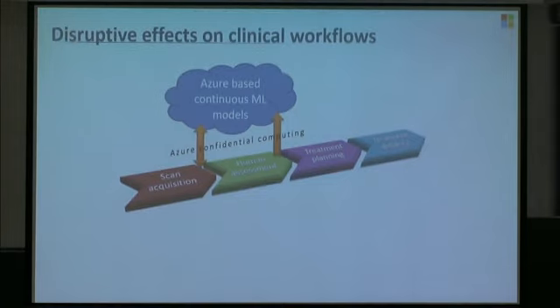What we've got now, and we've just got permission from Information Governance to do this, is the radiomics tool we're using now in Addenbrooke's. We have a device in our radiotherapy network that takes the pixels from the images that we scan and feeds them up to ML models that are actually based in the Azure cloud. One thing that made that happen, released just earlier this year, is Azure Confidential Computing. This is end-to-end encryption of data that goes into the cloud for analysis. The transmission, even at the actual computation stage, be it on a GPU or CPU cluster, and it coming back, is all encrypted. And that was a major enabler.